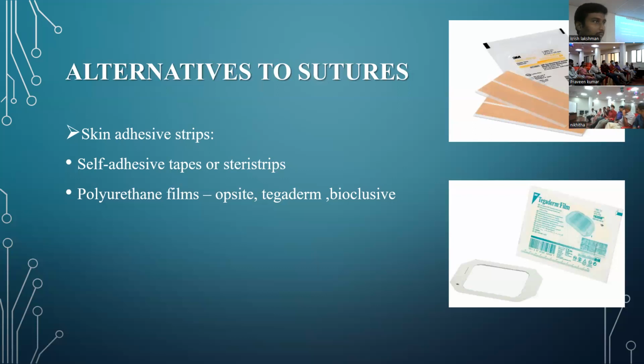What is the role of tissue glue in emergency? Usually we use it in children. Less application, easy to approximate, no need to do much work. Yes, the scar becomes equally good if you approximate properly. Where you cannot use it: in infected and deeper wounds. It will not work if it is bloody or wet. The wound has to be dry for this glue. If it's bleeding, for example, you cannot use it.